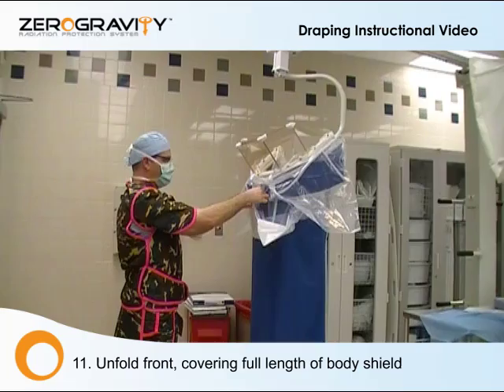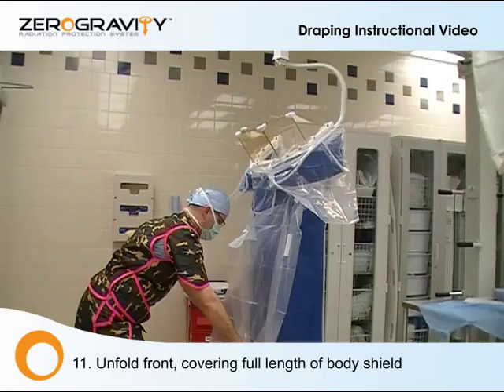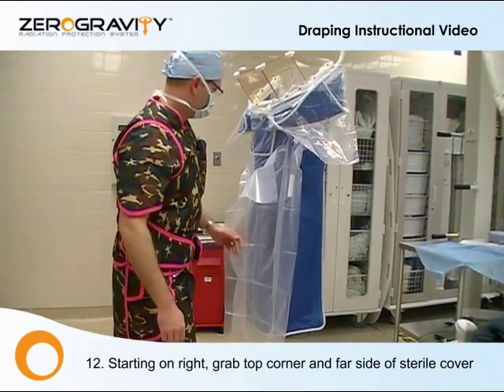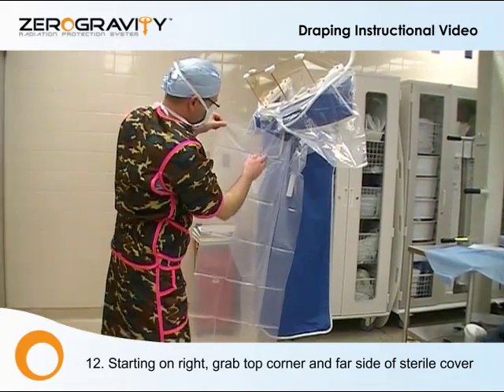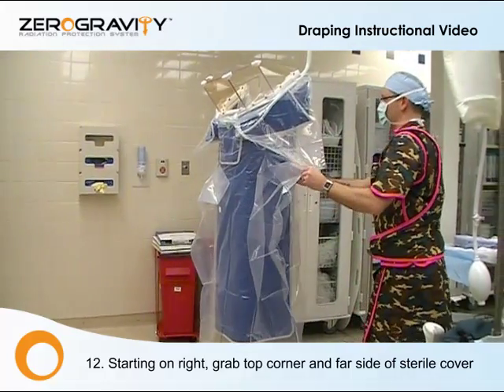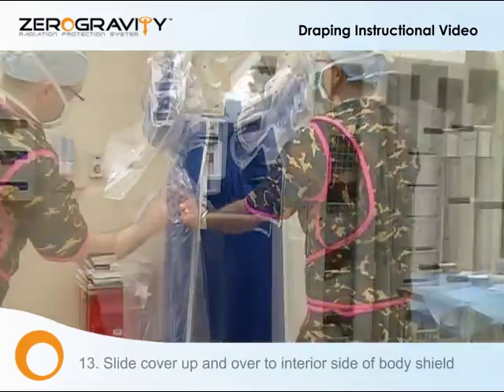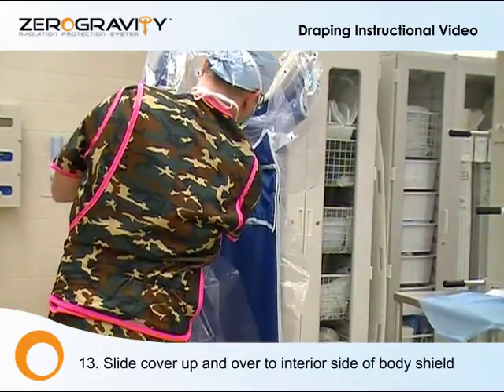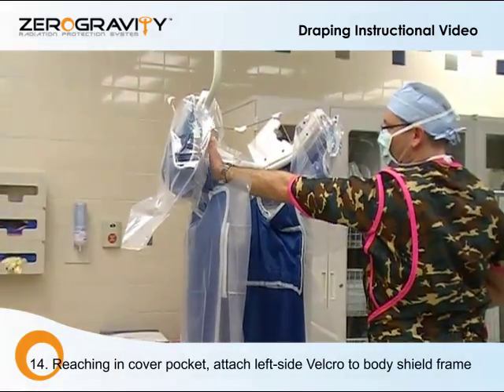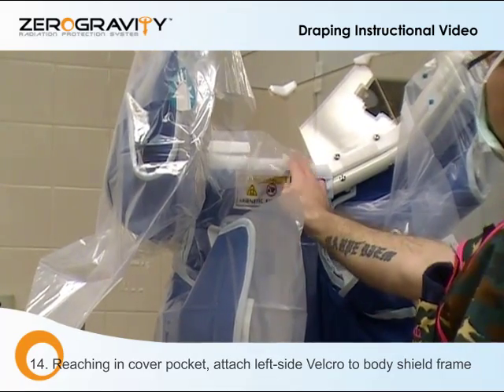At this point, we have the base started. We are now going to unfurl the front. Remember, maintaining sterile technique. Again, working from your right side, we're going to grab this corner, grab inside here. This motion is an up and over. At this point, you're going to start to reach in the pocket and apply the Velcros where they lay, at the top.